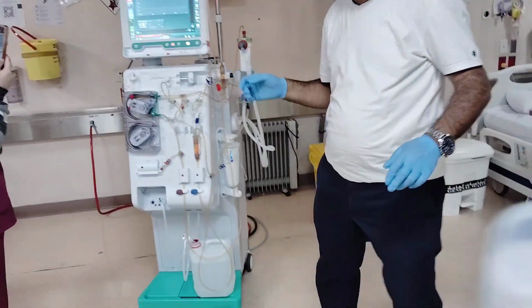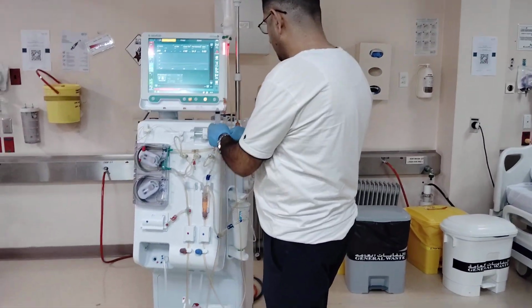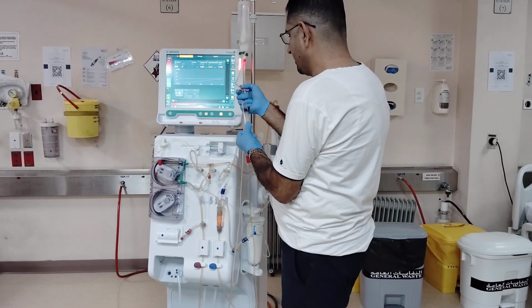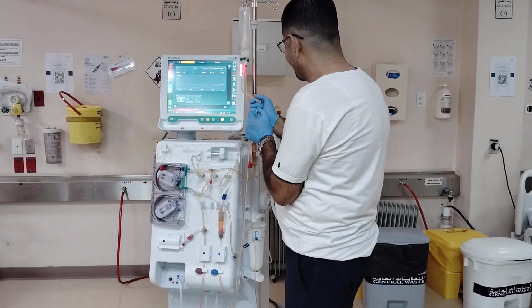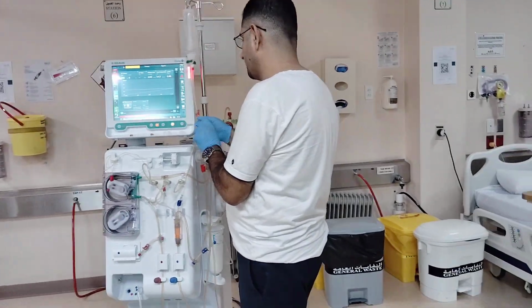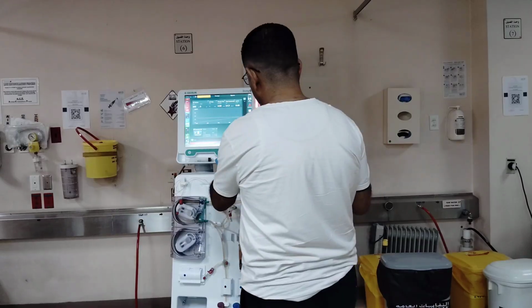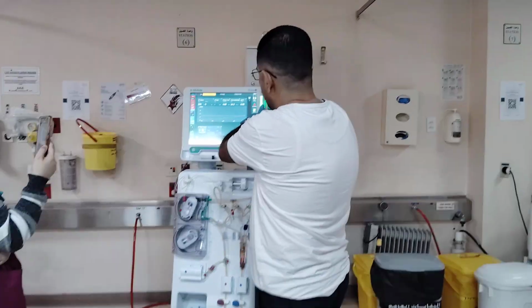Some clamp. It's blocking. Now the flow is running.